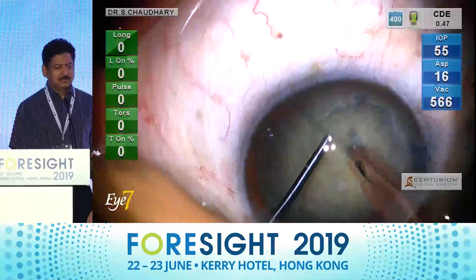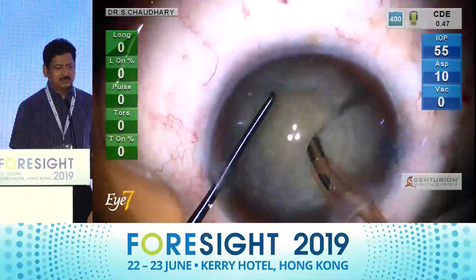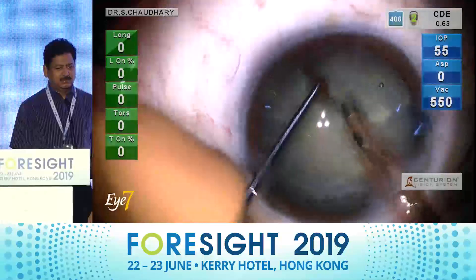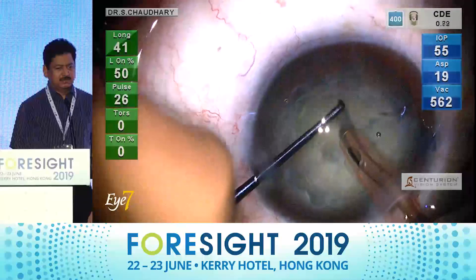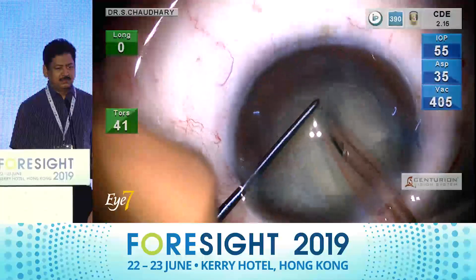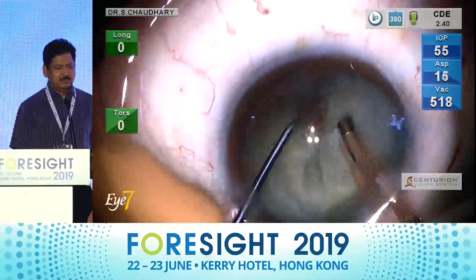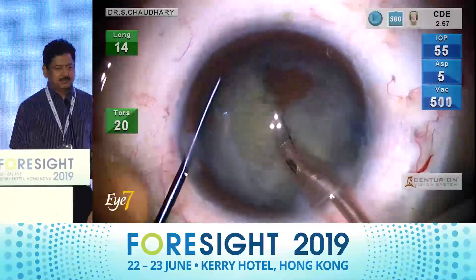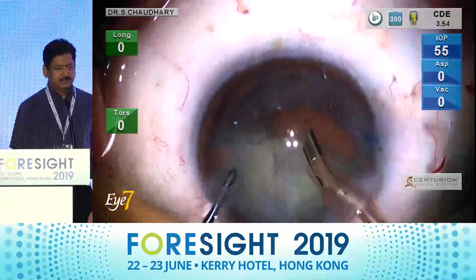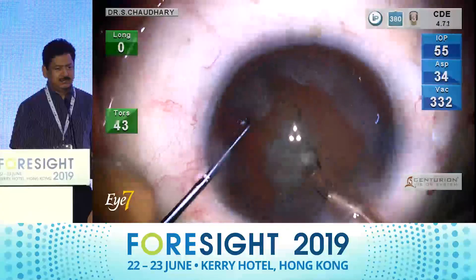I am now doing a grade three phaco. The chopping is purely with the longitudinal phaco. Notice the grip as I bury my balance tip into the substance of the nucleus — the grip never slips, and I get good chops on my nucleus. The moment my chops are complete in the bag, I move on to torsional phaco and the cataract gets dissolved within seconds. The CDE of the whole procedure is under five.